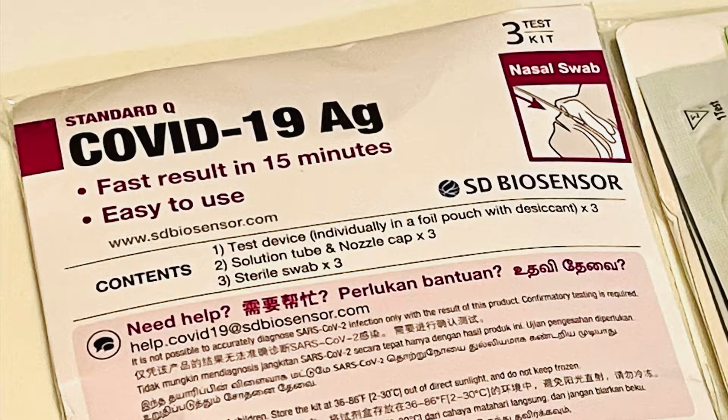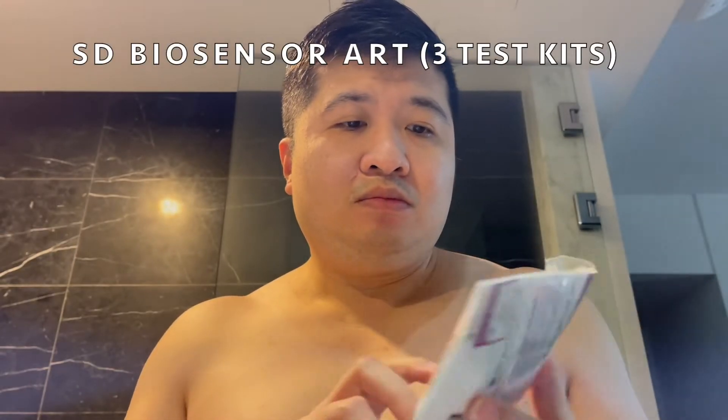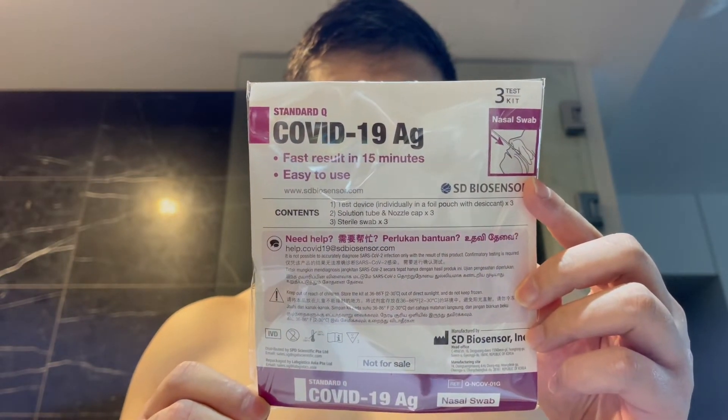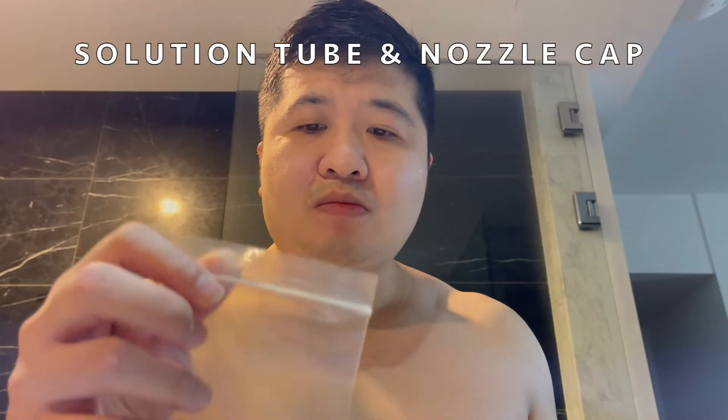This is the antigen rapid test from SD Biosensor for self-swab testing for COVID-19. There are three sets of test kits in this package. Read carefully the self-swab instructions. This bag has the solution tube and nozzle cap. Inside this foil packaging is the test device. This is the sterile swab.